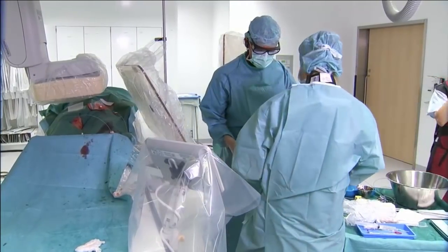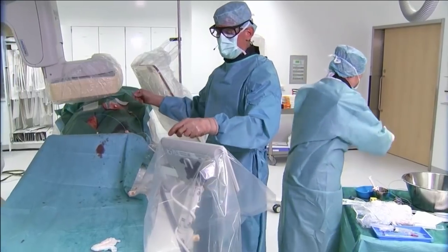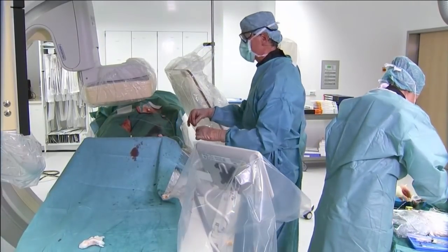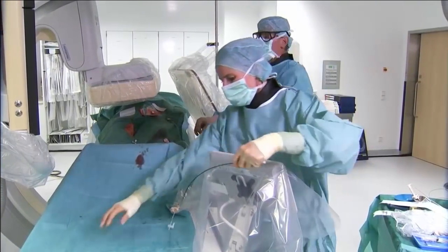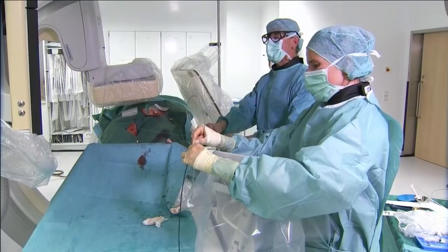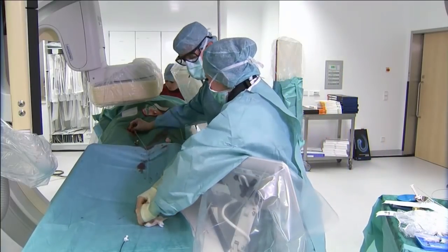Yeah, I know. For this step, of course, we need a little bit of time. And we have to approach that concept step by step with many different angulations and movements of the C-arm to have the appropriate direction upwards. So let's see whether we can do this in that time. What we also will do, we will engage a Judkins 6 French guiding catheter from antegrade down to the common artery to position the tip of the catheter right there where we actually want to hit.